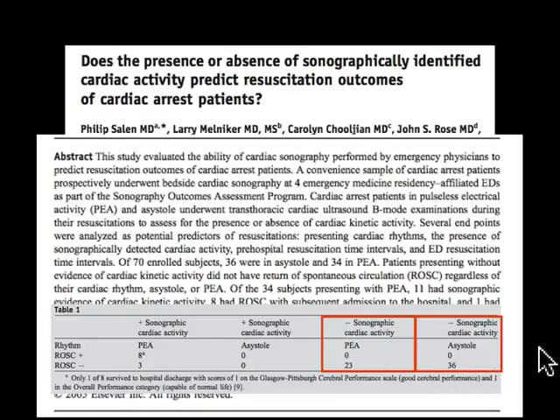There's a study going on right now. There's 61 sites. We're one of the sites looking at this exact same concept called the REASON study that Rod Mortazavi, one of the medical students, is sort of in charge of. And so we're looking at that now as one of the many centers doing this to try to find, is there any situation in which a patient could actually survive who had cardiac standstill on their ultrasound.